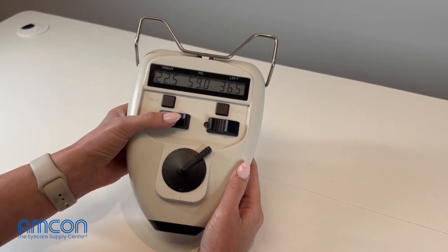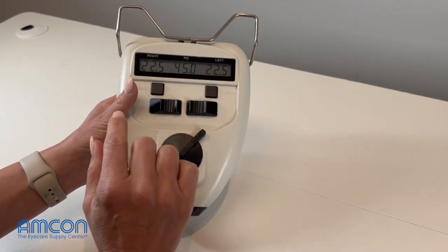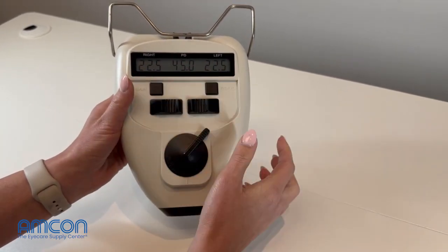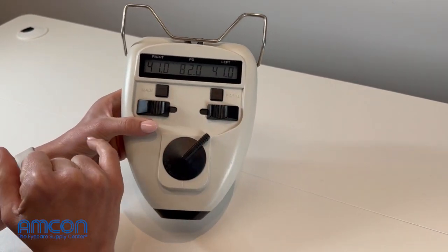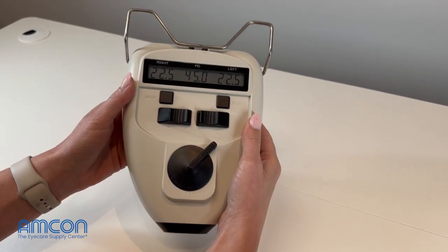Your pupilometer now reads in 0.5 millimeter increments on both sides. To confirm it's calibrated, push both sides towards the center — they'll both read 22.5. Push both towards the outer edges and you'll read 41 on each side, with a combined PD of 82. Your pupilometer is now ready to use.